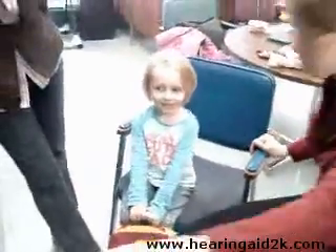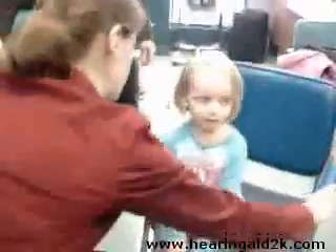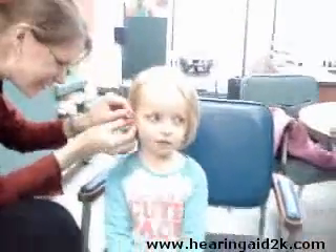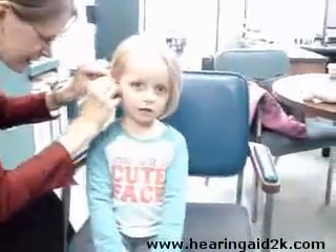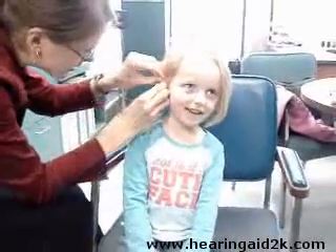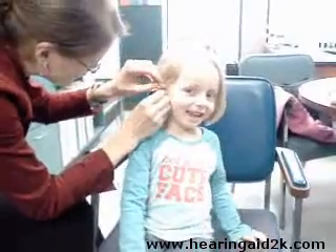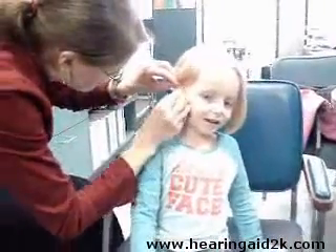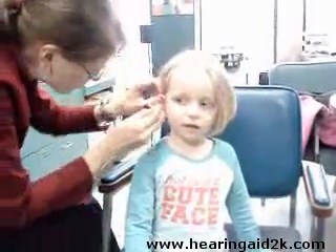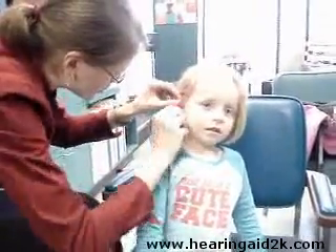I've got one for your other ear — let's try it. Is it okay if I put it in now, Emily? Yes, okay, let's get it in this ear. So let's put the ear mold in — it feels kind of funny going in, but then you can hear really well. I'm sorry, I didn't get that in your ear all the way. I'm sorry, Emily — I've got to put that in one more time, trying again.